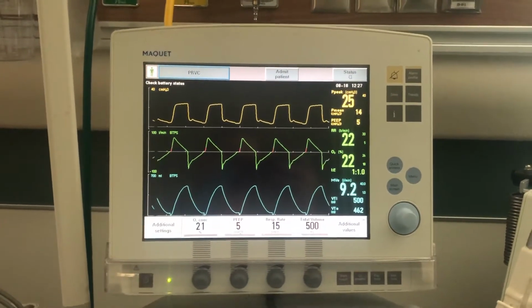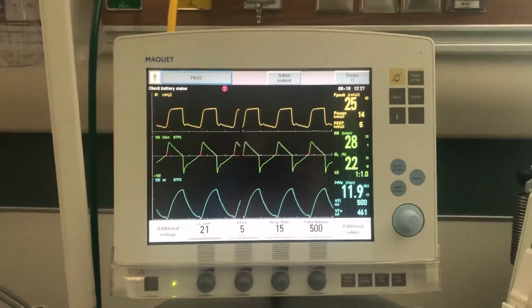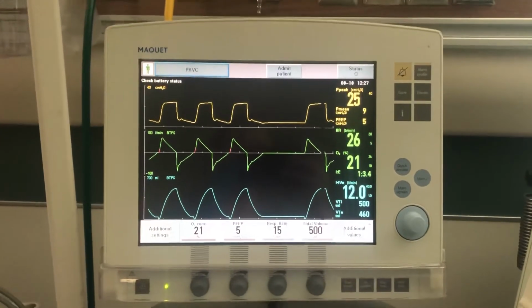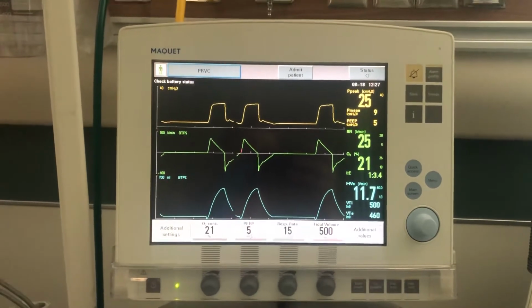This is a video describing the steps for RSBI. When the therapist walks into the room, the patient is on PRVC, tidal volume of 500, a respiratory rate of 15, a PEEP of 5, and 21%.